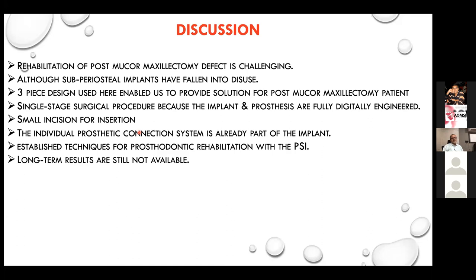Subperiosteal implant has a long-standing history, but it has fallen out of use. The only reason is that in those days, it was a two-stage method where they used to expose the area, take an impression, make the cast and send it for fabrication in the lab. The second stage involved opening 15 days post-op. The only problem is the adaptation of the implant to the bone, which was not very precise because you cannot replicate the same thing on the cast.